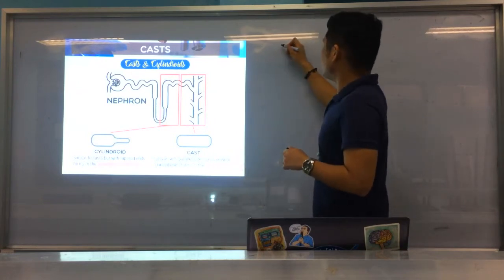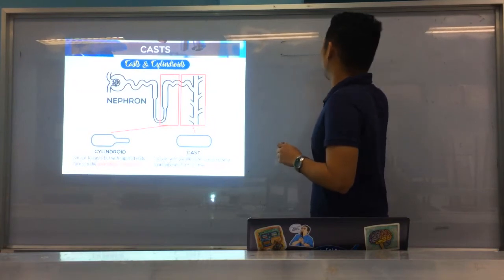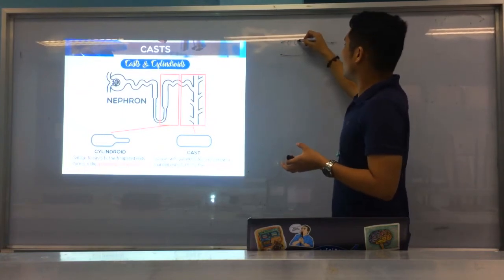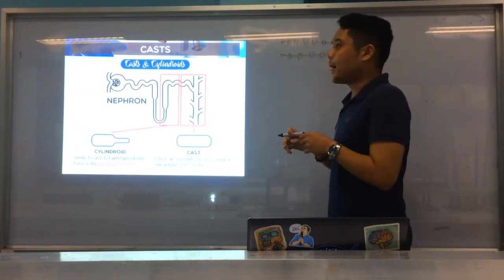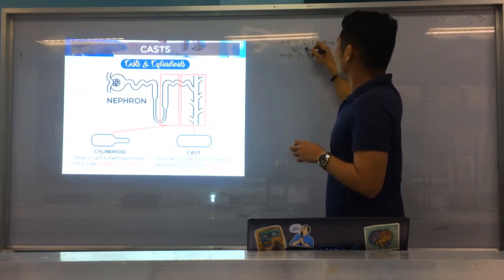Okay. So, first, let's say I'll draw a tubule. Okay, now, let's say this is the tubule of the distal convoluted tubule. Now, di ba daghan na siya mga RTEs, dira, gapalibot, of course, because that's a tubule. So, ma-release na sila uromodulin, okay? Now, uromodulin, what happens is, mag-release sila uromodulin, it will now form a cast matrix, okay?